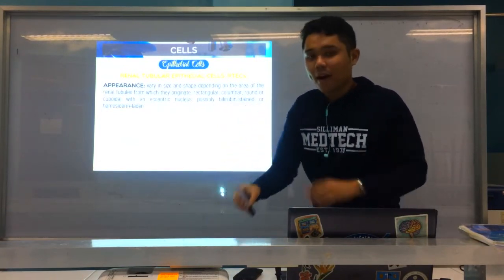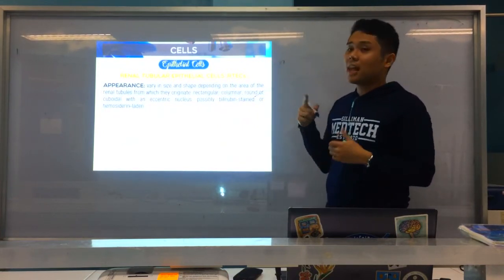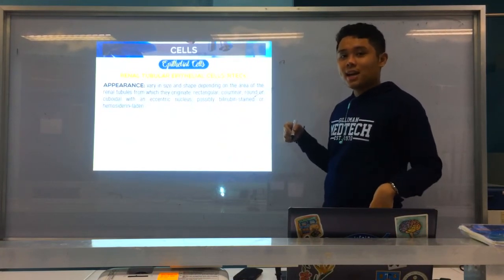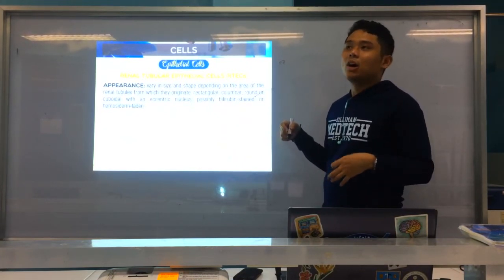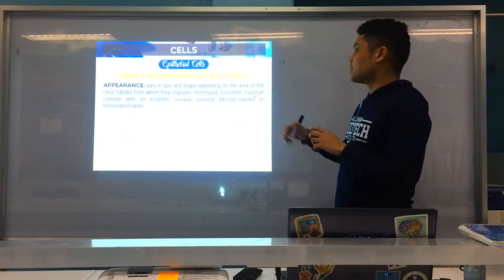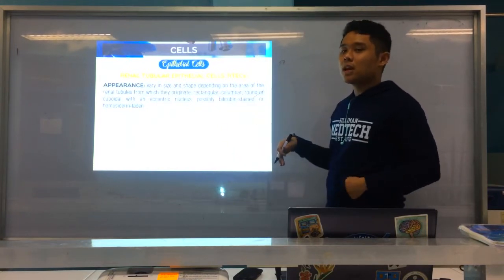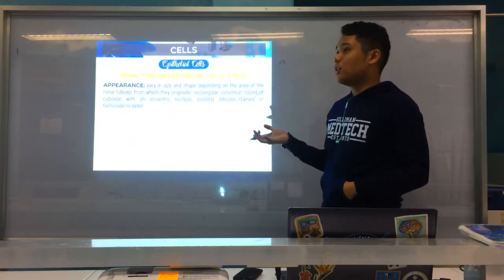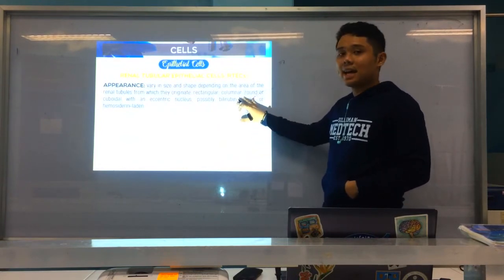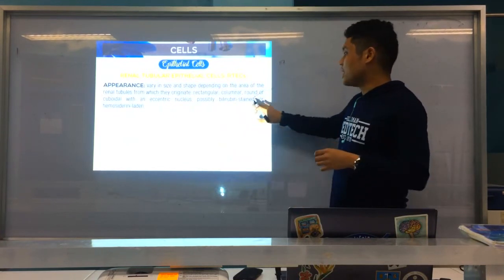Now, di ba in our chemical exam, bilirubin stained because in times na liver damage, di ba, mo release og bilirubin ang ihi. The presence of bilirubin happens or occurs in the ihi na. So what happens is pwedeng ma-absorb na siya sa imong RTEs. And if nakay problems sa imong tubules, masulod or ma-release po ng RTEs sa ihi na naay bilirubin. So pag stain niya, ma-appeal po ang bilirubin. So muna siya bilirubin stained. Usually seen again in liver disease.